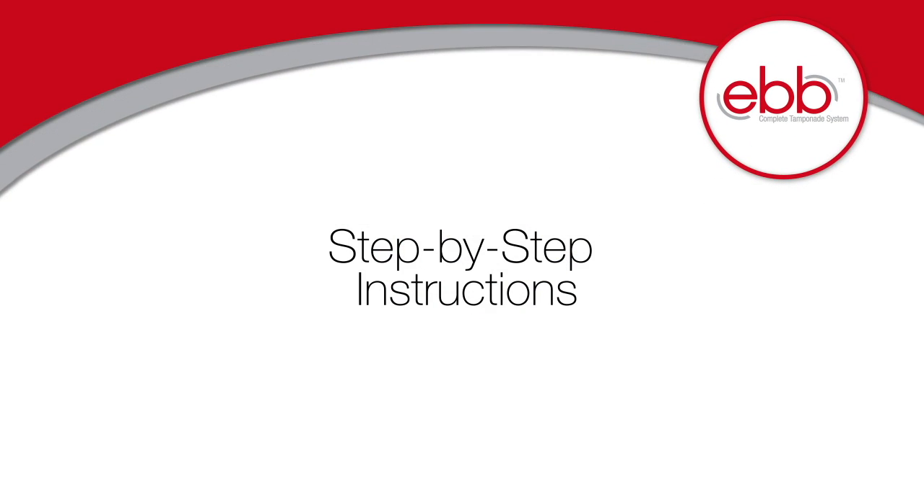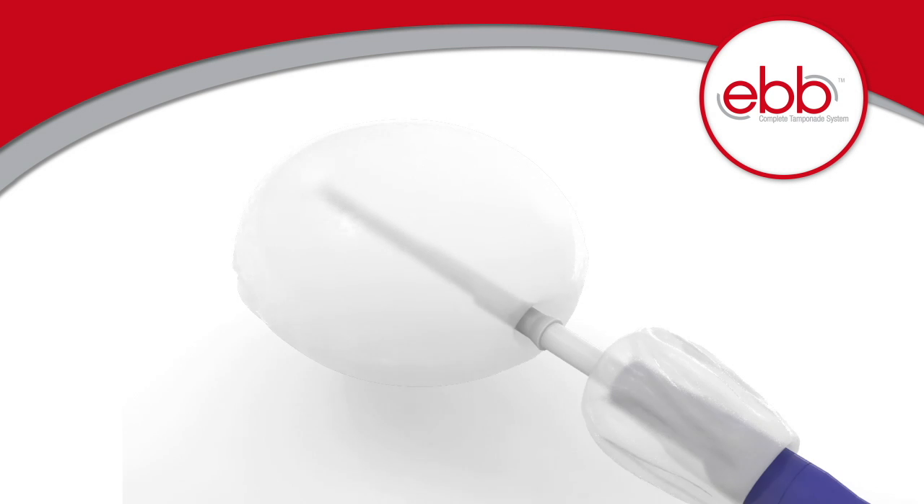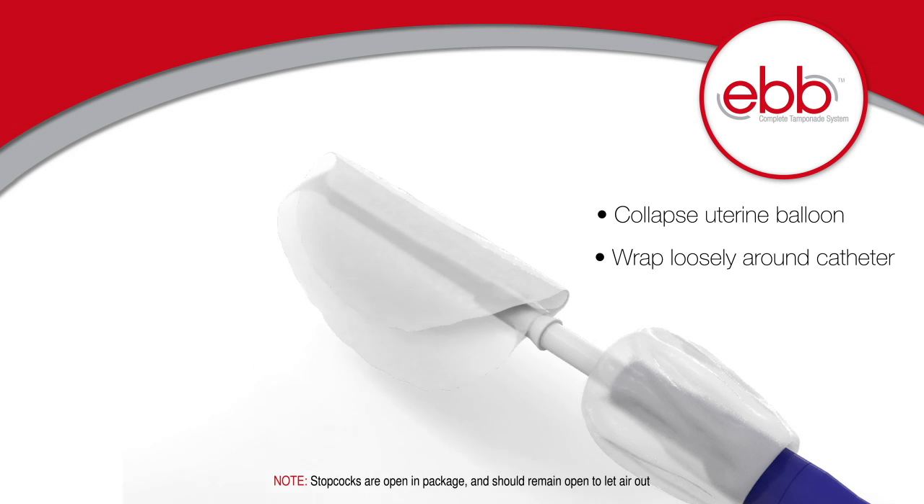Step-by-step instructions for using the Ebb Complete tamponade system. Step 1: Collapse the uterine balloon and wrap it loosely around the catheter for easier insertion. Stopcocks should remain open to let the air out.